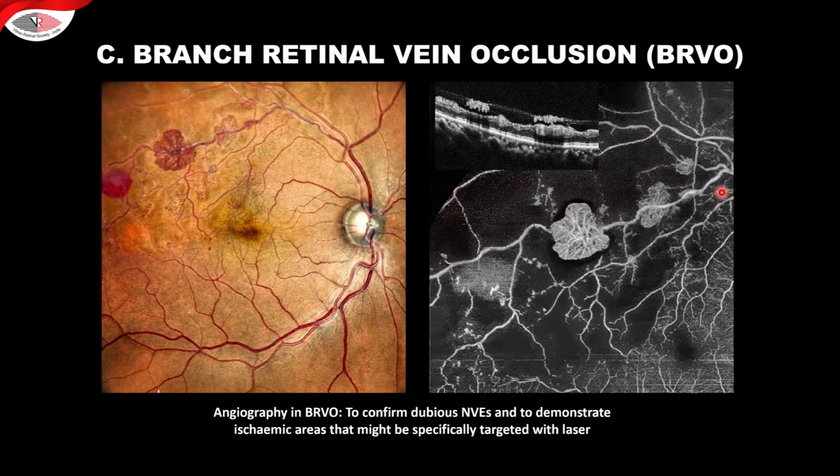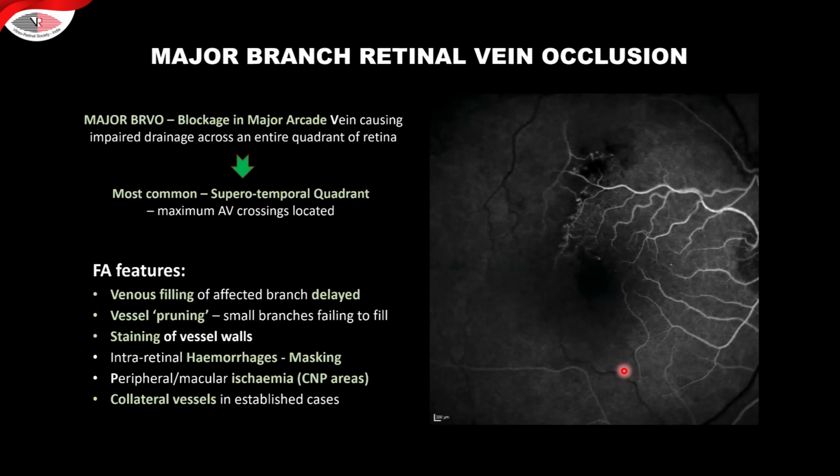Coming to the branch vein occlusion, it will usually be one geographical half of the fundus that is affected, superior or inferior, and here you see changes that are taking place in the superior fundus, and you can see the OCT angiography changes, which show these small circular petalloid areas of the vessels which have formed with chronic BRVO here, with non-perfusion areas seen. And if you look at the OCT, these changes are seen just over the hyaloid by these hyperintense areas which are seen here, making an interesting picture in BRVOs.